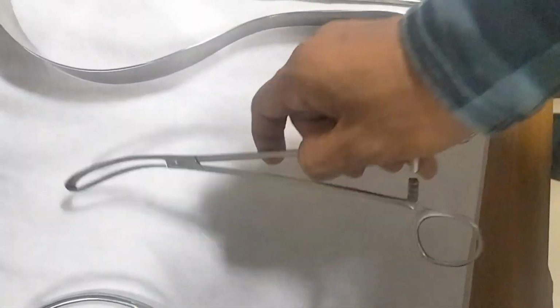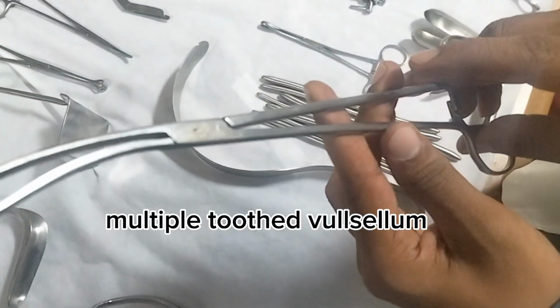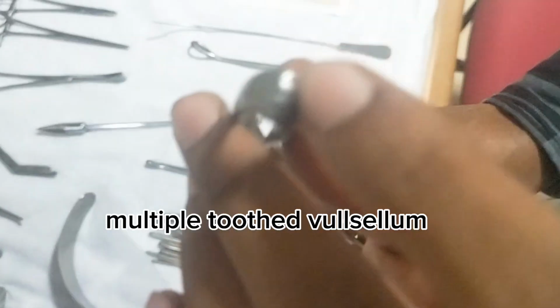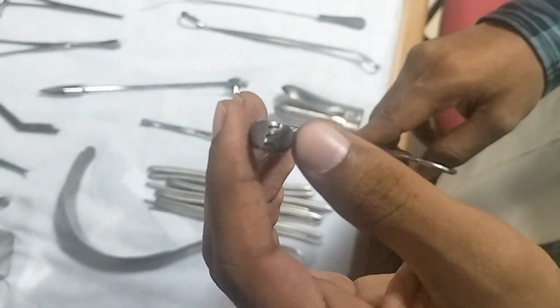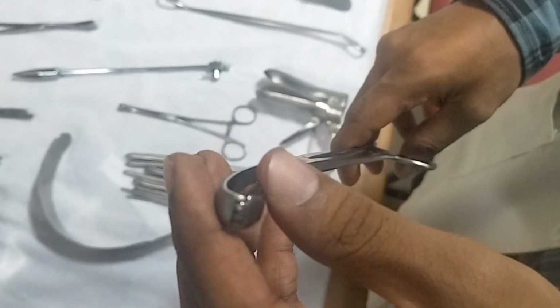Multiple tooth vulsellum. Here you can hold this in this finger. We got in the proximal end ratchet, one lock, second lock, third lock, and long shaft. And in the distal we got curved blade with tooth projections. It is used for holding anterior lip of cervix, and indications could be intrauterine inseminations and removal and introductions of intrauterine contraceptive device, in vaginal hysterectomy.